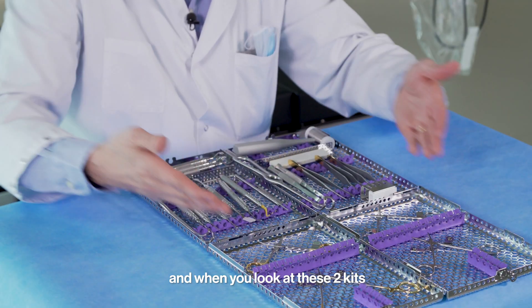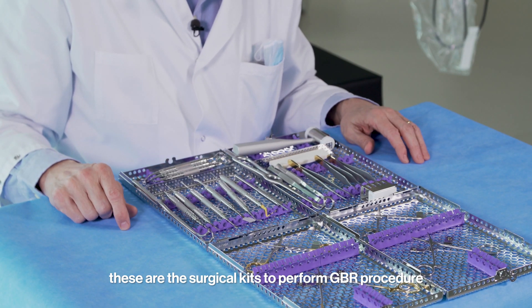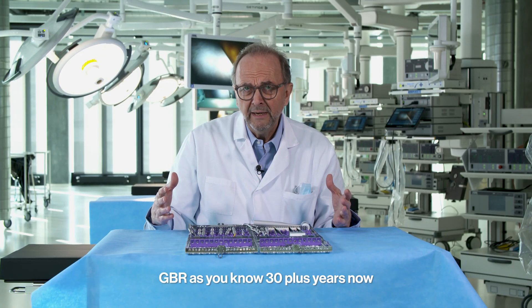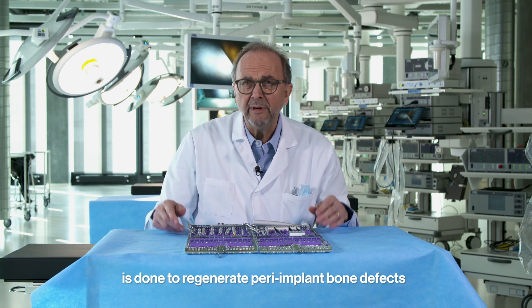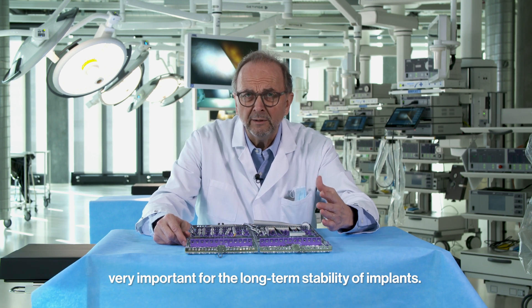When you look at these two kits, these are the surgical kits to perform GBR procedures. GBR, as you know, for 30-plus years now, is done to regenerate peri-implant bone defects, which is very important for the long-term stability of implants.